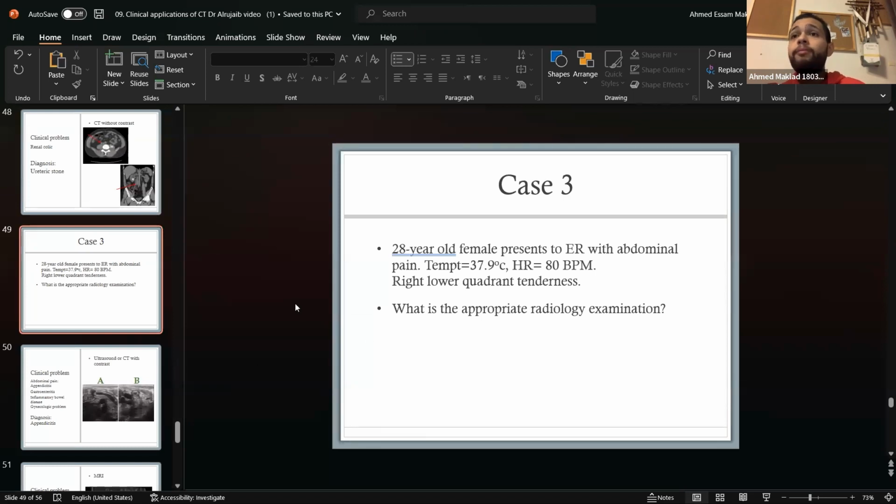Why MRI? MRI is better than CT scans, but it takes way longer. Yeah, it would take longer, but you don't care if it takes longer because she is hemodynamically stable, right? Her life is not in danger. Why is it safer? Because it does not use X-rays. MRI does not use X-rays at all. It uses magnets. All right, you're welcome.